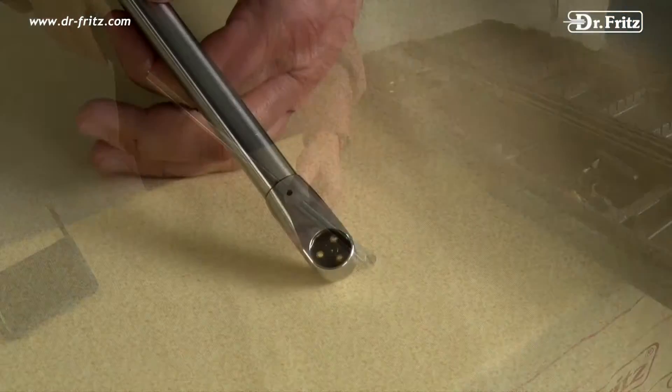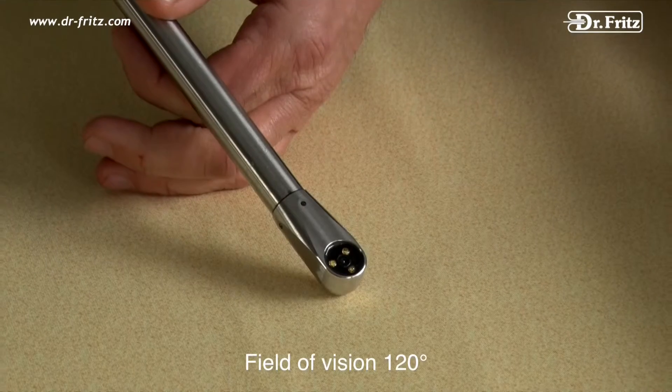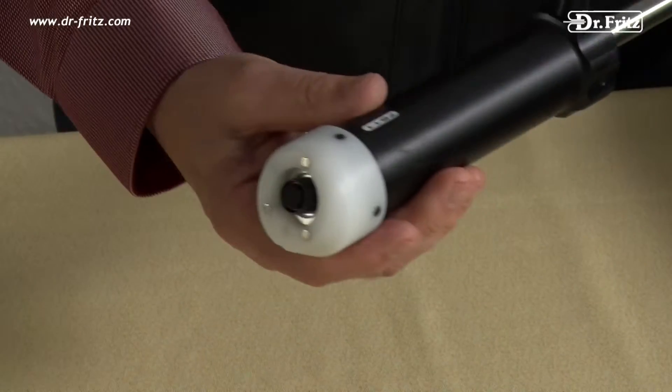The 90-degree angled high-resolution lens has an aperture angle of 120 degrees, making it possible to examine the complete horse tooth up close.